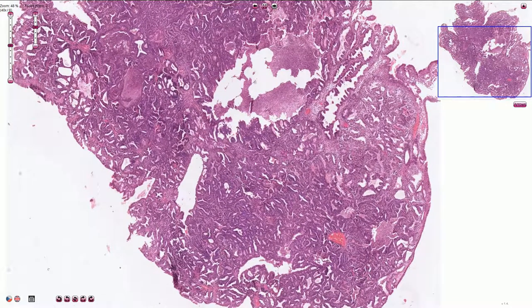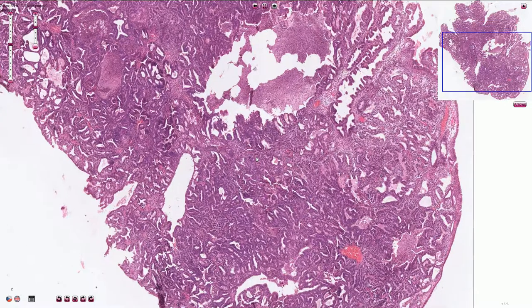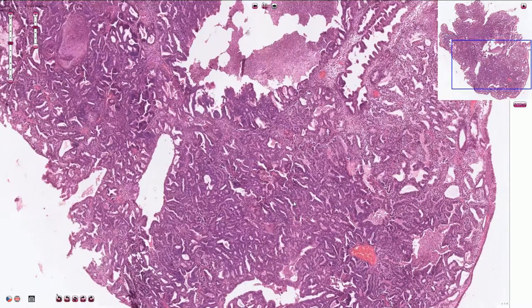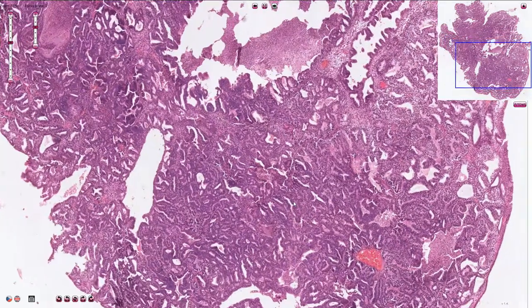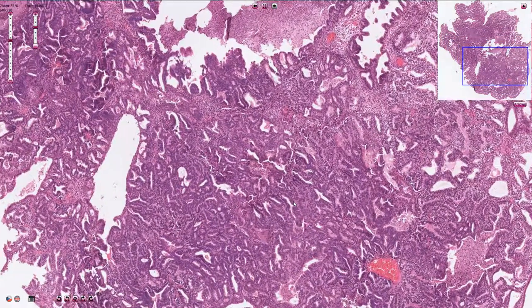Microscopically, it typically resembles proliferative phase endometrium. However, the endometrial glands are atypical — they are back-to-back, tightly packed without intervening endometrial stroma, and we can see an invasive type of growth.